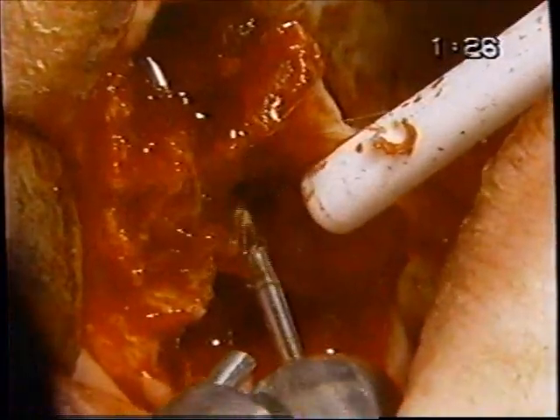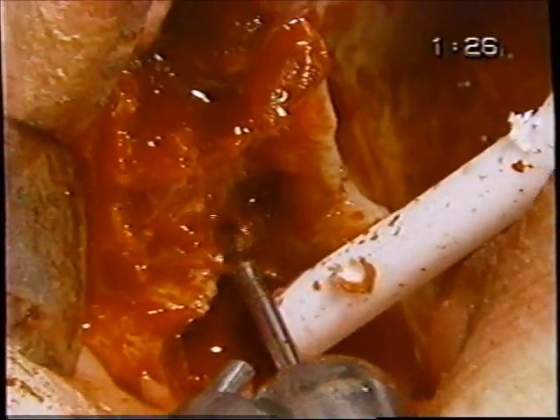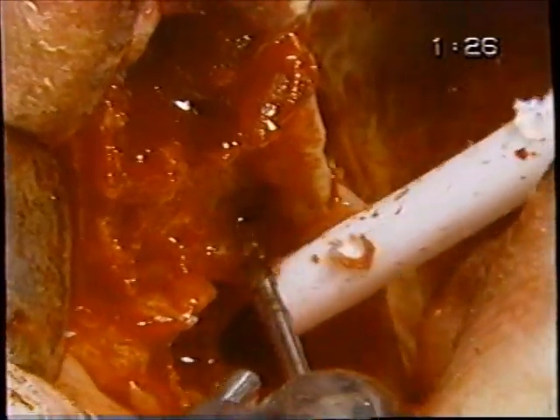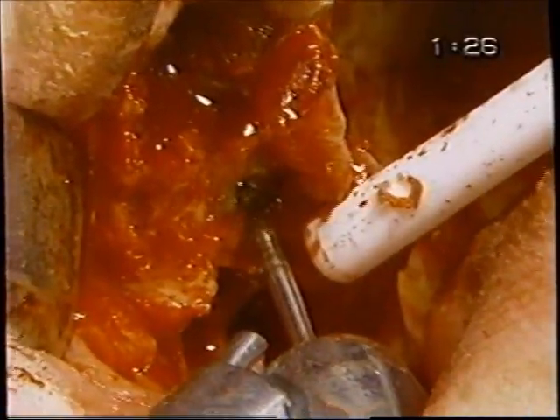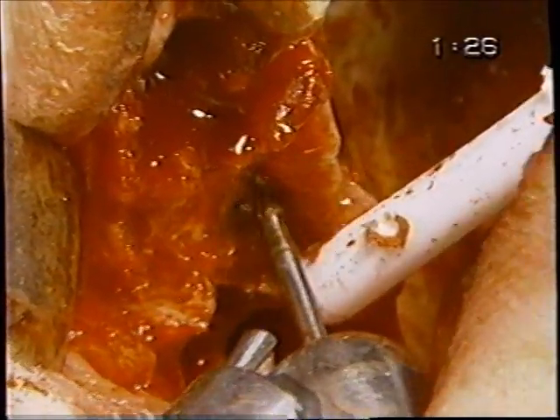I took out the 2 buccal roots, and it was hard to localize the palatal one, but by using the burr to wrap up and remove some of that soft tissue, and Susan, if you'd suction, come around at a better angle, I can see that it's still there. There it is. We can see the little black dot. It's the canal. But it's hard to get a purchase around that, really hard.